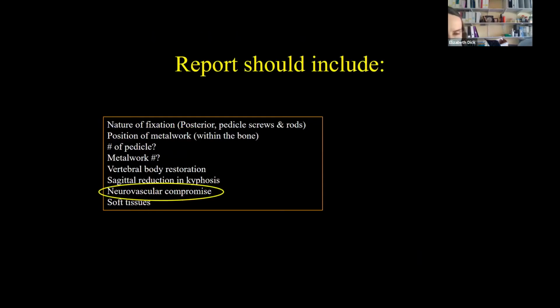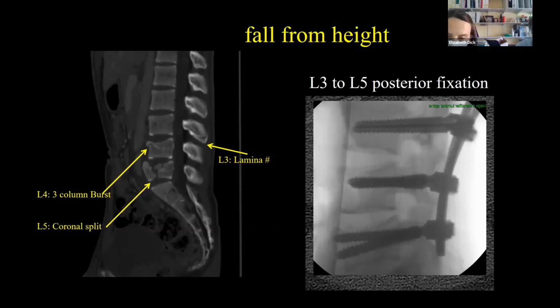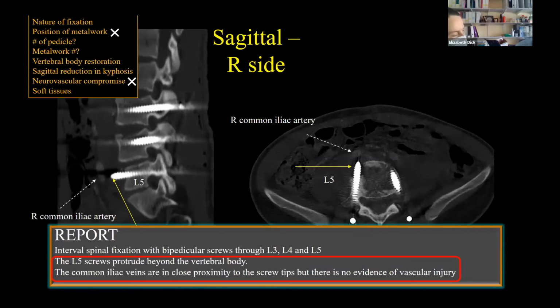So thinking a little bit more about neurovascular compromise, I just want to show you this patient who fell from a height. They've got a 3-column injury at 2 levels in the lower lumbar spine. Let's have a look at the posterior fixation in this patient and particularly at the screws. I know that you said it's important for the screws to be well engaged in the vertebral body, but the screws in this patient protrude a little bit anteriorly, don't they? We can see that they're relatively closely related to the common iliac artery, although the artery is fine. But that's another thing to consider, and also to word quite carefully, I suspect, the report.